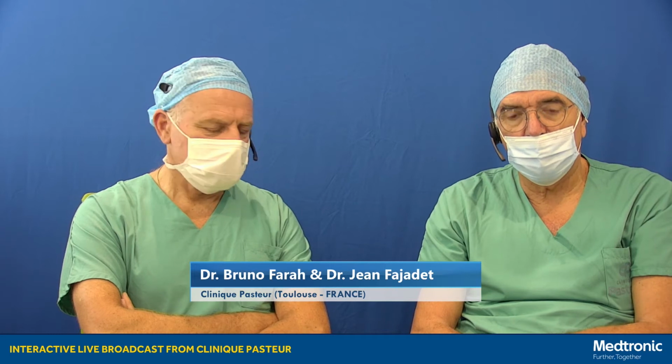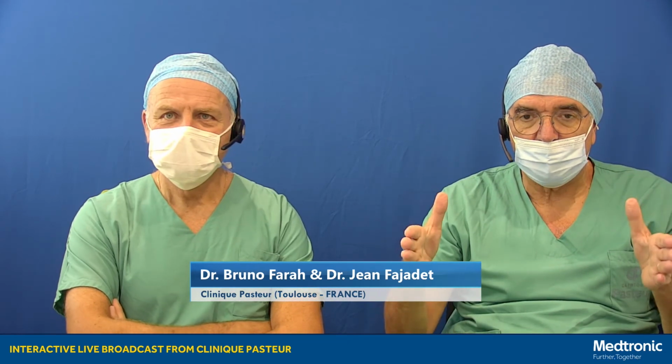Second, it depends on the result that you get from the PCI, the number of stents implanted, the length of the stents implanted. It's different from what we have done today. In other words, only 2 stents in a very large vessel, 5 millimeter, and then 4 millimeter for the proximal LAD, with a good result. No additional stent at the ostium of the diagonal branch. So we have 2 stents, not too long, in a very large vessel. And it's true that in this particular case we can reduce to 1 month of triple therapy.